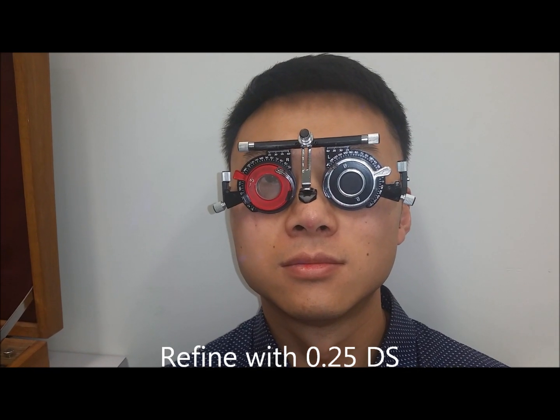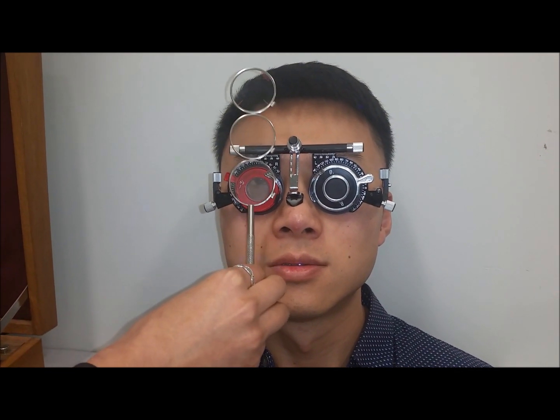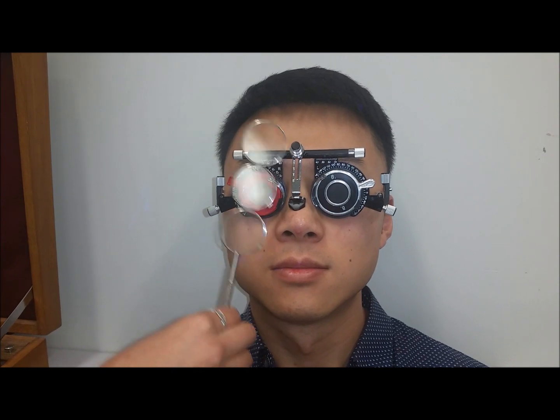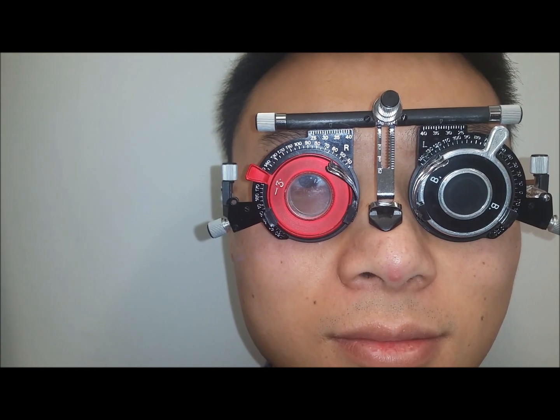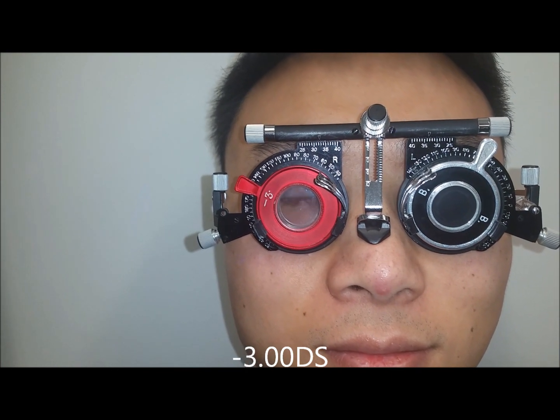Yep, so I'm just going to get you to tell me what's the lowest line you can read down to now. The fourth line, A, O, H, T. Yep. So I just want you to tell me the same things before. Is it better with or without? It's almost the same. Yep, and is it better with or without? It's almost the same. After establishing the initial best sphere, we can see that Hongbin requires a minus 3 lens.